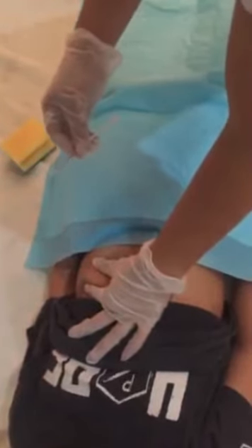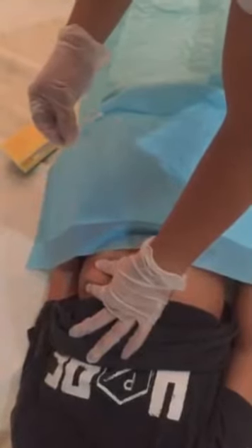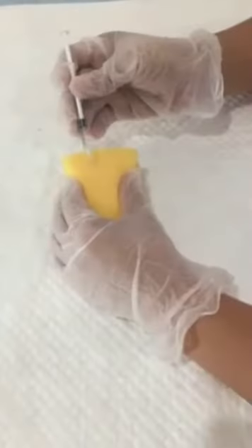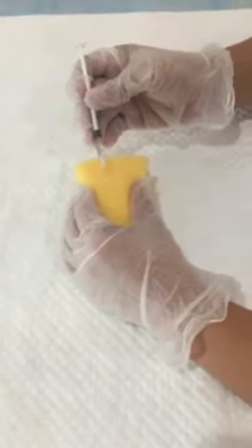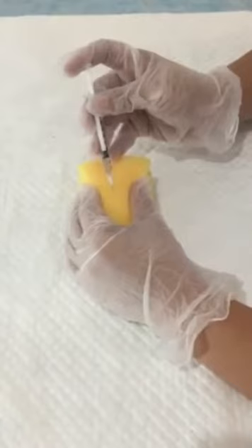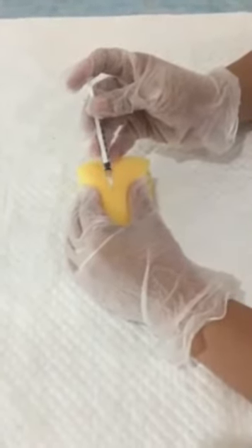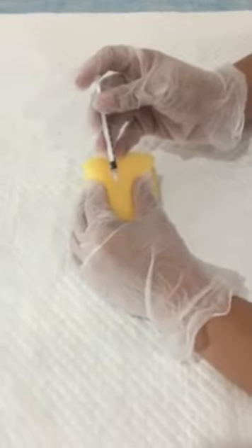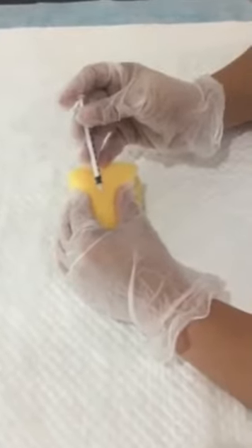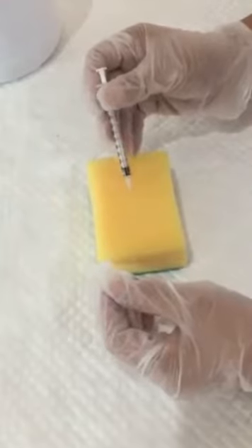Remove the needle cap. While waiting for the antiseptic to dry, pull the cap straight off to avoid contaminating the needle by the outside edge of the cap. The needle will become contaminated if it touches anything but the inside of the cap, which is sterile. Dispose of the needle cap, then inject the medication. Grasp the syringe in your dominant hand, holding it between your thumb and fingers with the palm facing to the side or upward for a 45-degree angle insertion, or with the palm downward for a 90-degree angle insertion.